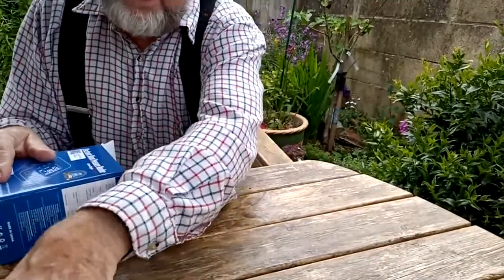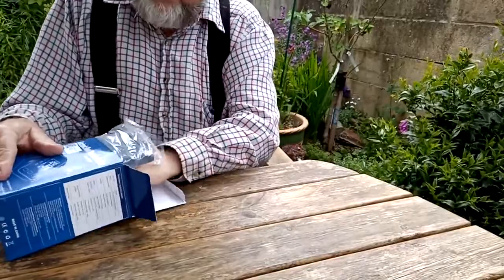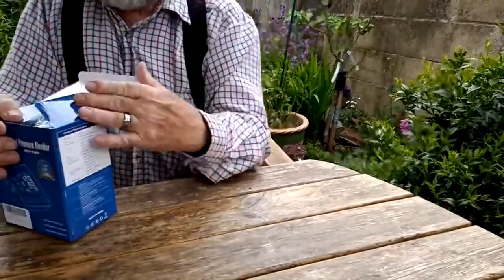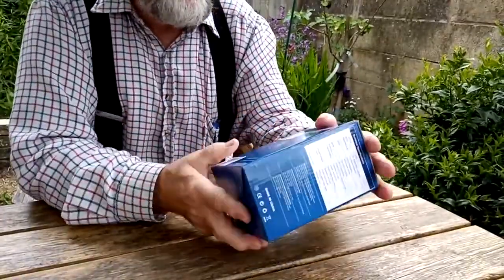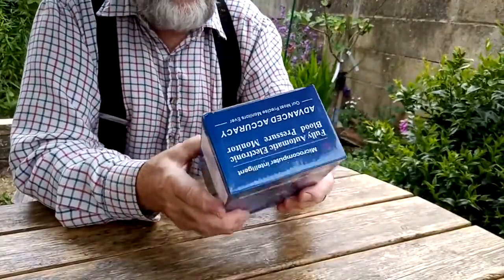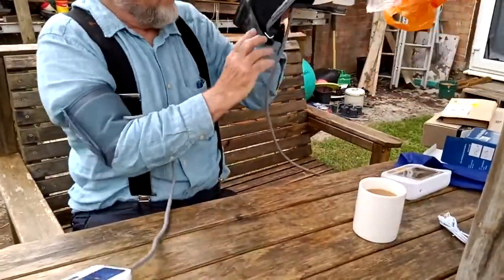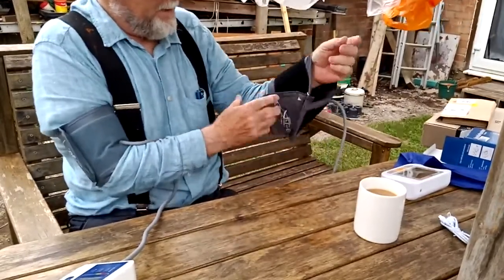We normally write ours down, well in my case I put it in an app on my phone, in my wife's case she puts it on a piece of paper, so we've got a list of dates and times anyway. But there we are, and there's 2 memories in this, so you can have it set up separately for each user.